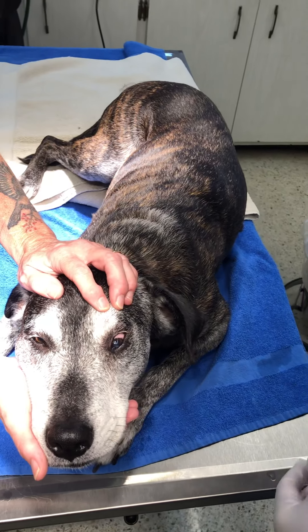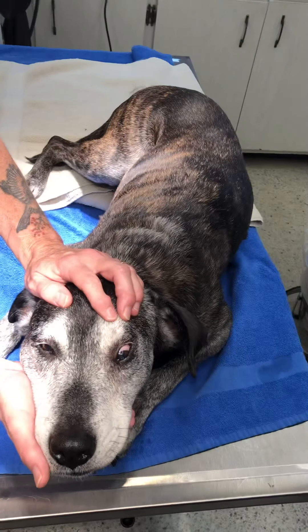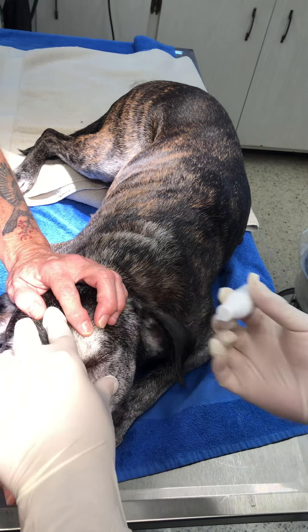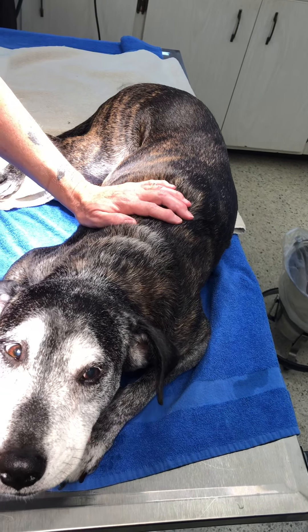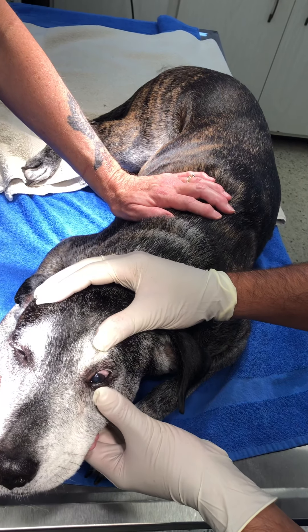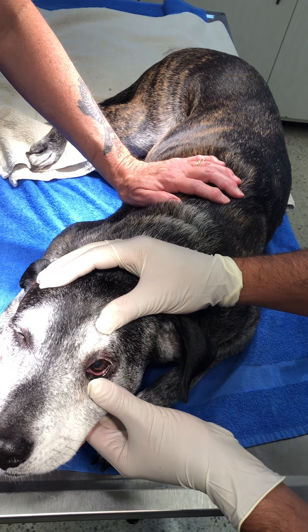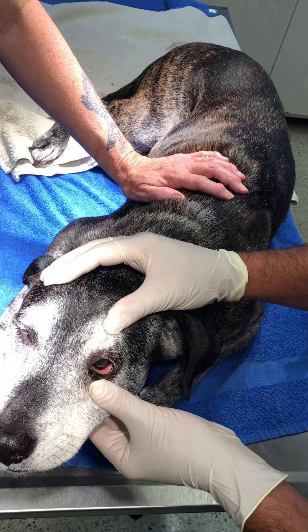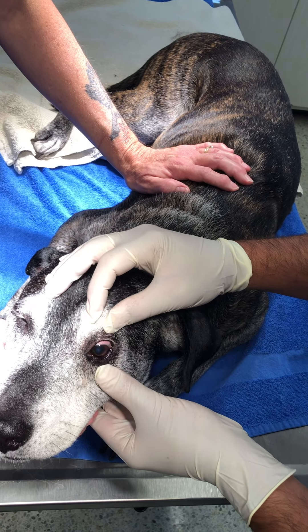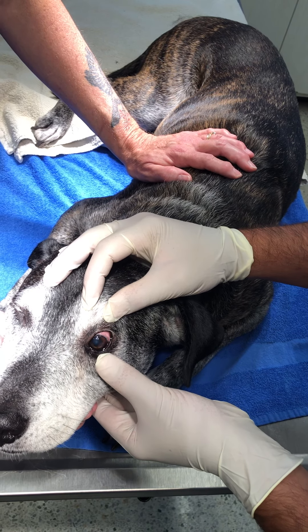We already gave a little bit of local anesthetic to the eye. The anesthetic is quite fast acting, so it won't take long. We perform an eye examination to try to find out if there's any underlying cause of the ulcer, and actually we find that nothing appears to be in contact with the cornea.